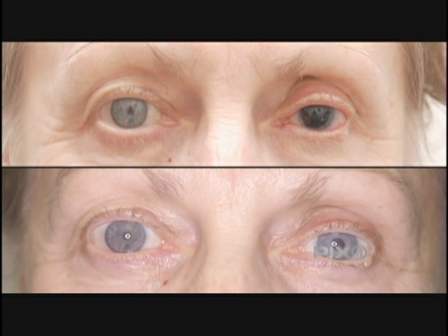All right, so here we got a couple of photos of some patients. Describe to me what we have here. So this is a very nice woman in her 60s who came to see me from North Carolina, who had been hit in the eye with a tennis ball. She suffered a retinal detachment, and her iris was completely destroyed, as was the lens of her eye. In the top picture, you can see her left eye, which is a black hole, and she had poor quality of vision in that eye.